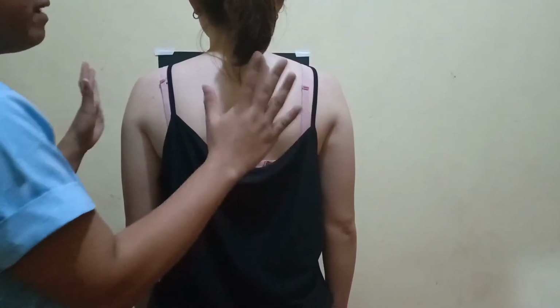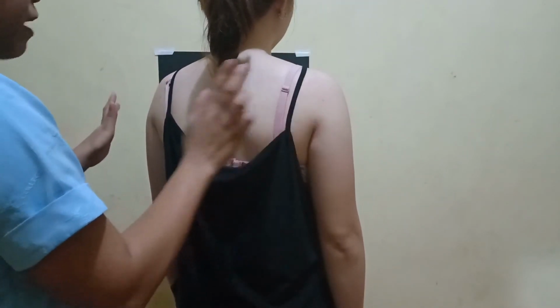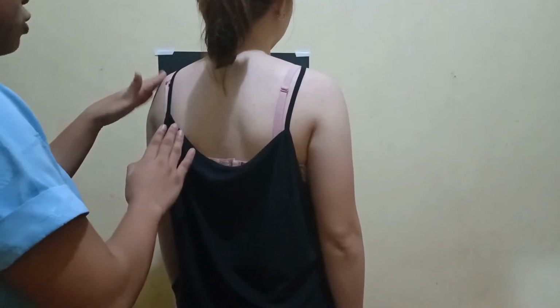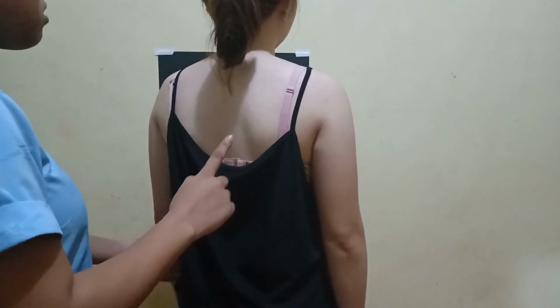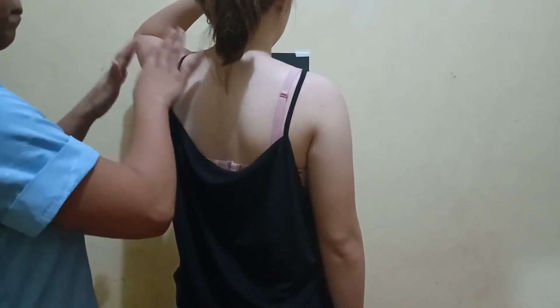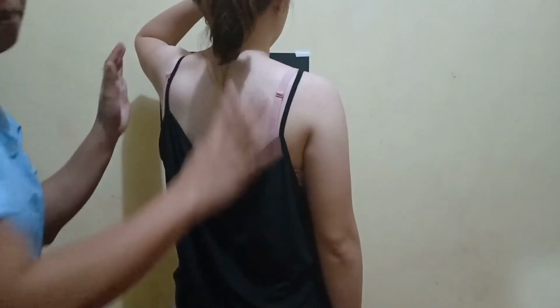So, anterior oblique the patient slightly. After that, palpate the patient's superior angle of the scapula, also the AC joint of the patient. After palpating, abduct the patient's arm slowly as not to superimpose the proximal humerus of the patient over the ribs. Then after that, do not attempt to rotate the patient's arm.